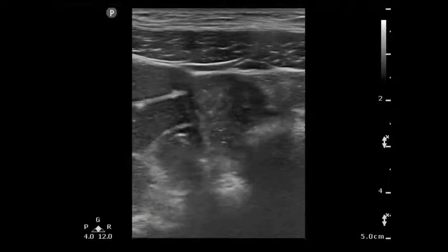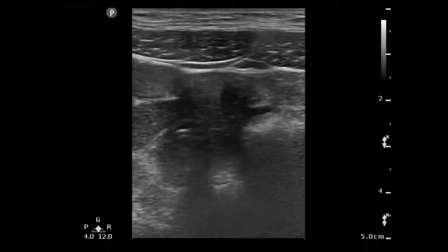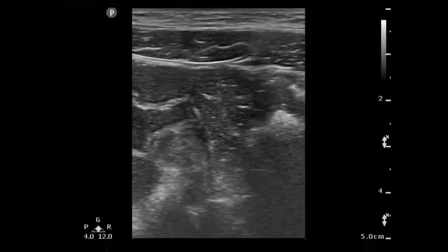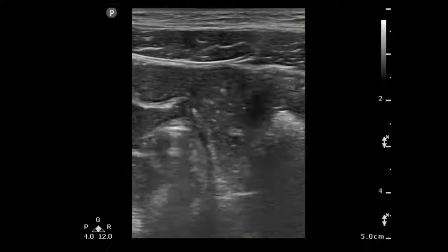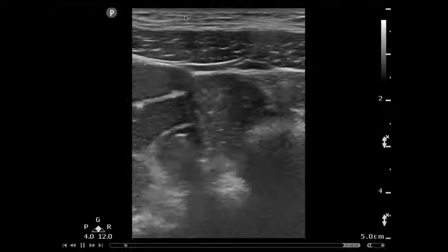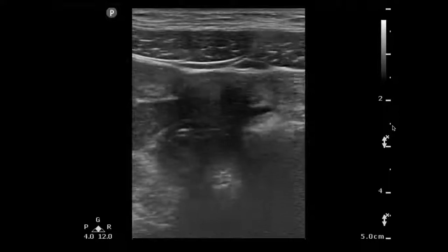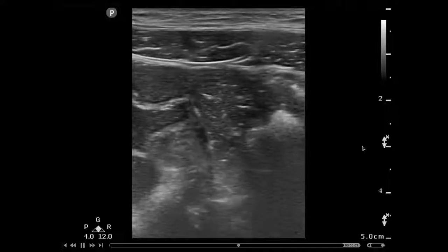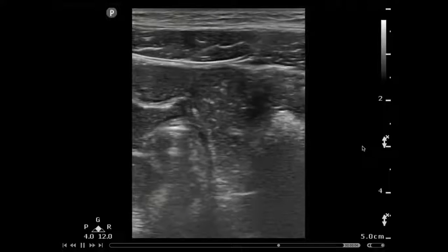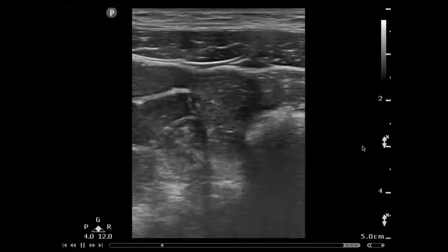You can use your linear probe if the patient's skinny enough. This is what normal bowel looks like with a linear probe. If you look at the tick marks on the side here and extrapolate, you can see that the bowel is less than 2.5 centimeters and it's completely collapsing.